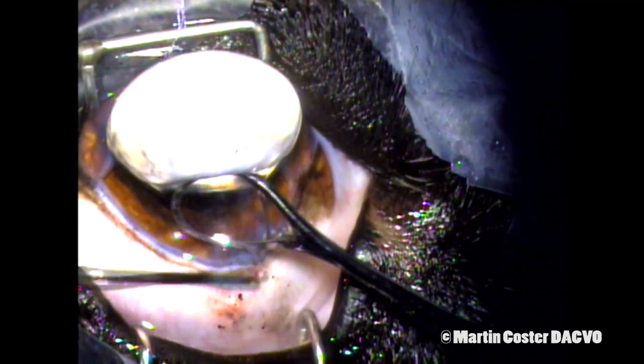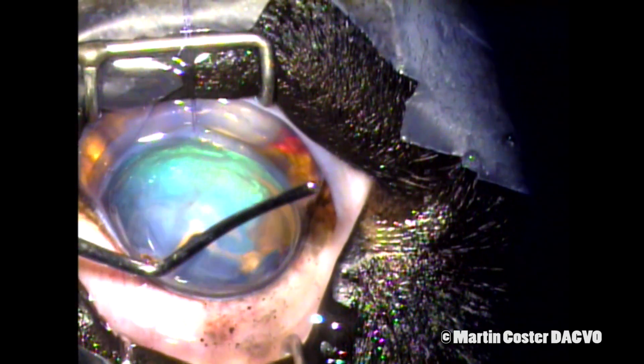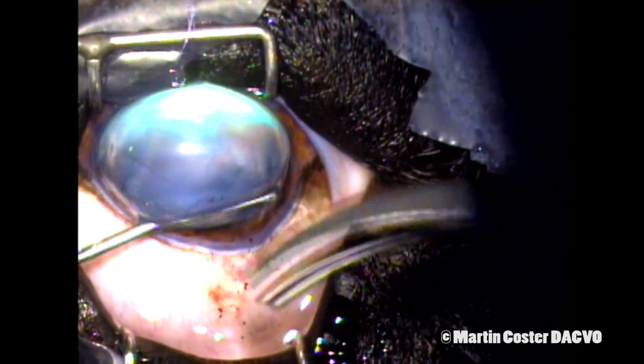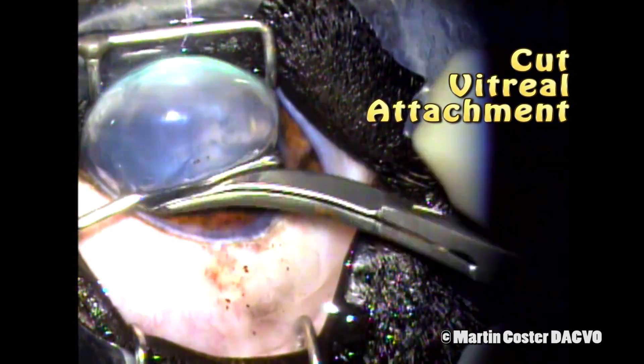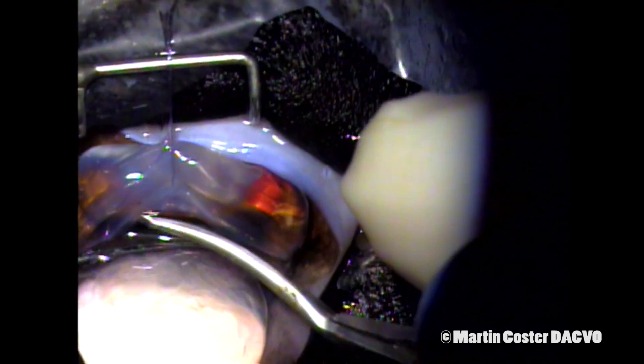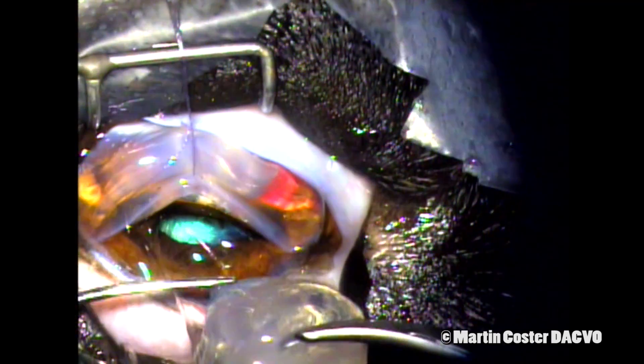The lens has vitreous attachments and so it wants to suck back in — you can see those here with the lens loop. We get a pair of scissors and trim off those vitreous attachments as we gently move the lens out of the eye. If you kept pulling with anterior traction on the lens, you'd pull on the vitreous more and that could induce further complications such as hemorrhage or retinal detachment. Here I'm trimming all around to get those vitreous attachments off the lens.